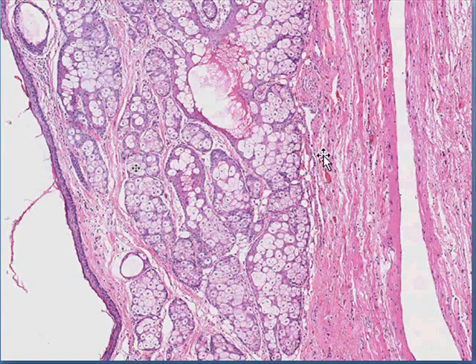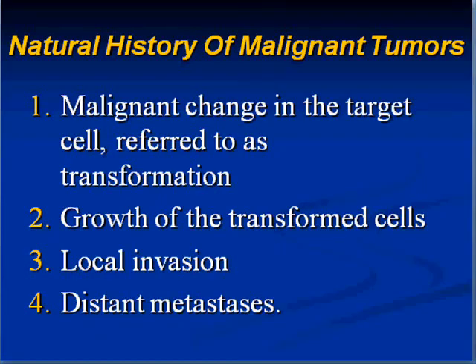This is a benign dermoid cyst, and just to show you that it is a teratoma because it gives rise to both epithelial as well as connective tissue elements.